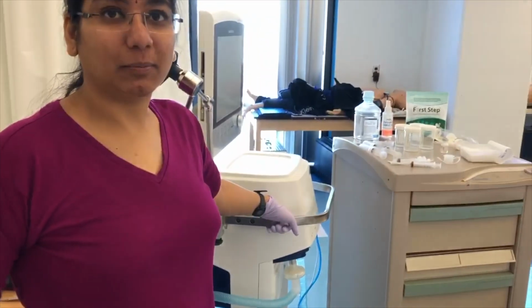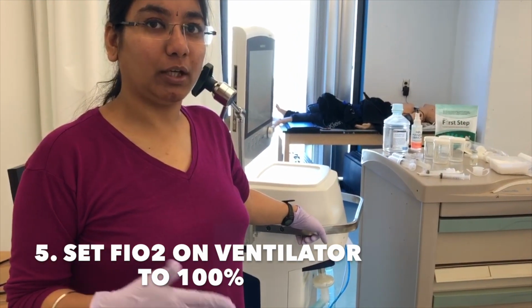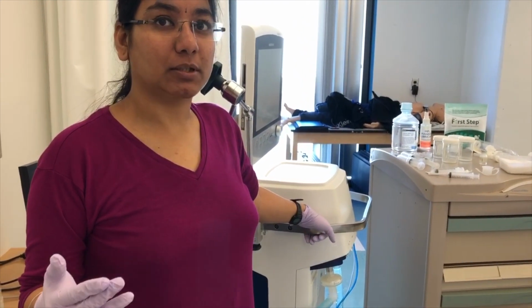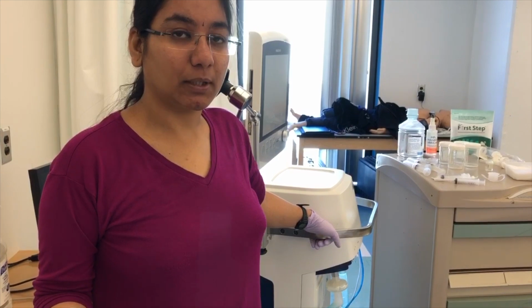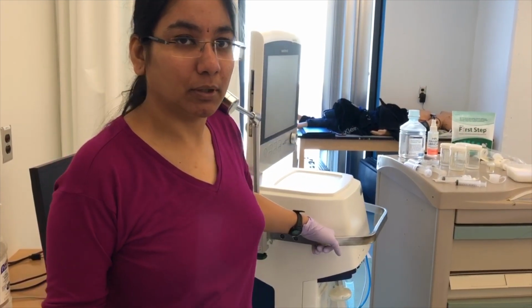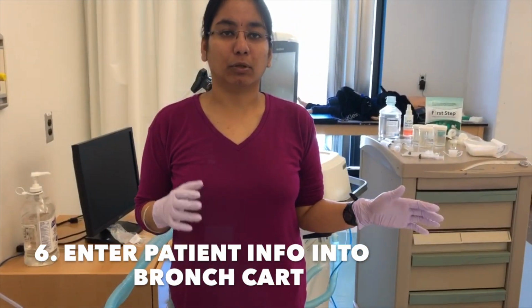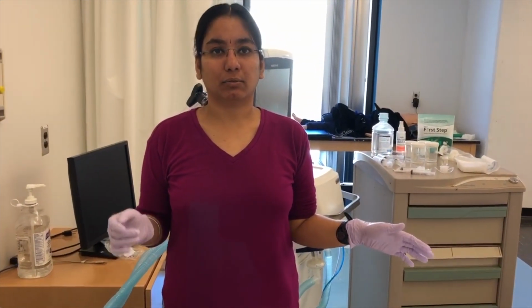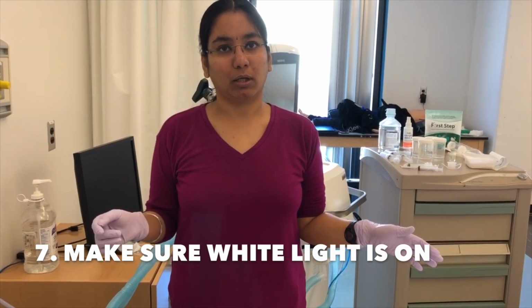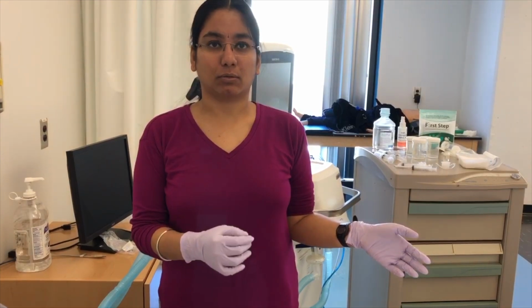And the patient should be hyperoxygenated with 100% oxygen during the procedure and for 5 minutes after the procedure as well, and make sure that the FiO2 is back to the previous setting. And the monitor should be set up with all the patient details, and the white light source should be on so that we can visualize when we insert the scope.